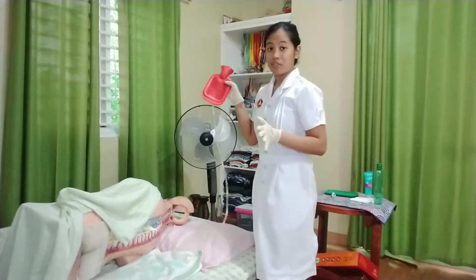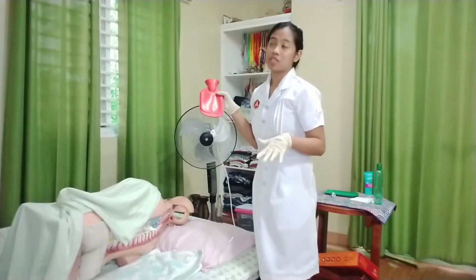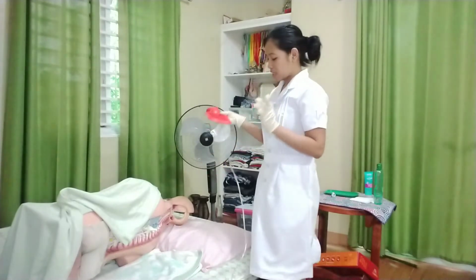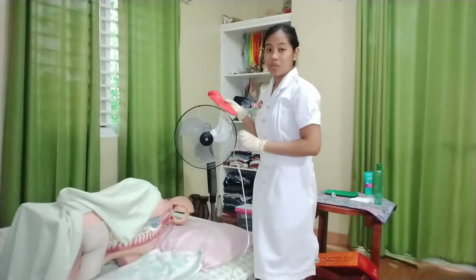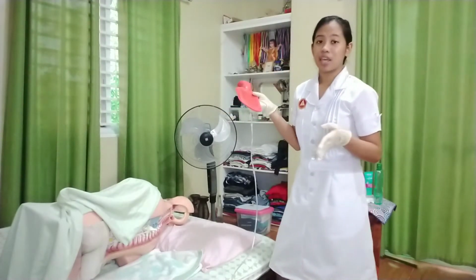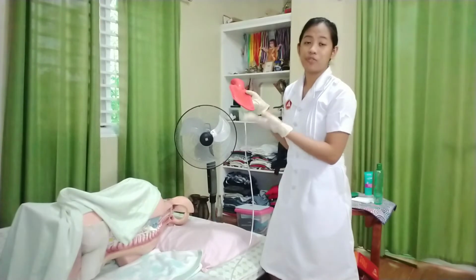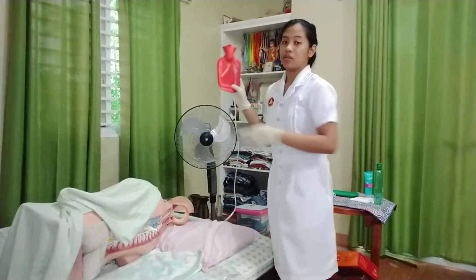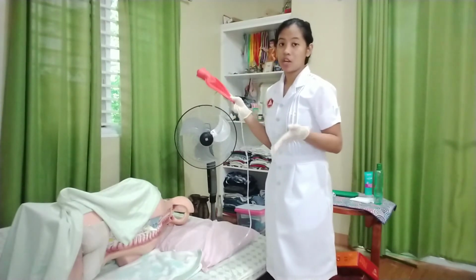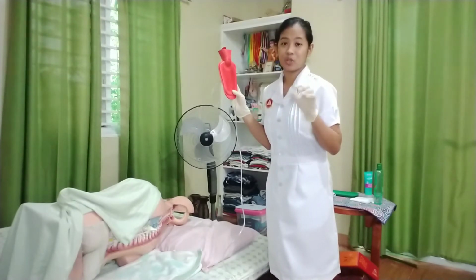So we will administer the enema solution slowly, and if the client complains of fullness or pain, we will lower the container and then close the clamp to stop the fluid flow for 30 seconds, and then after that, open it again and let the fluid flow at a slower rate. So when using a plastic commercial container in administering the enema, roll the container as the fluid is instilled.